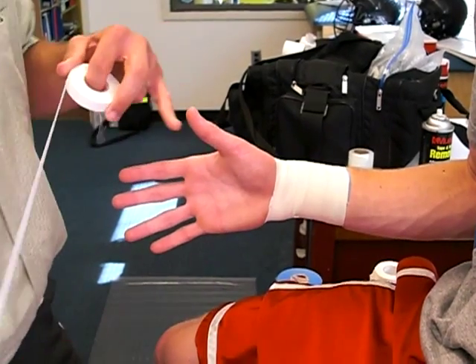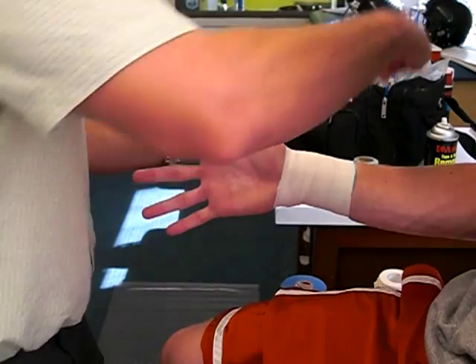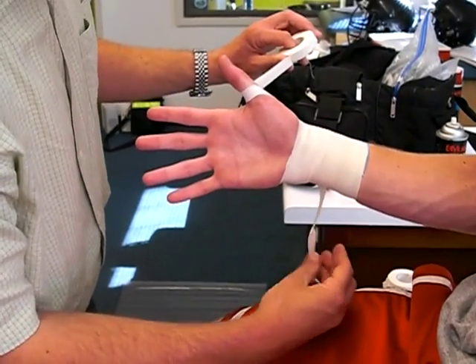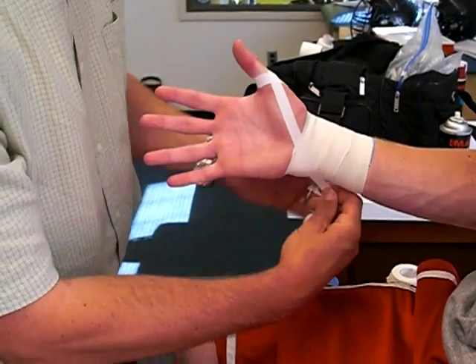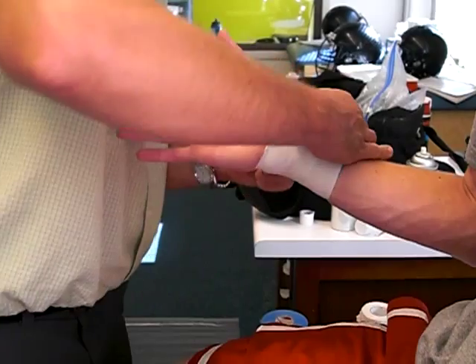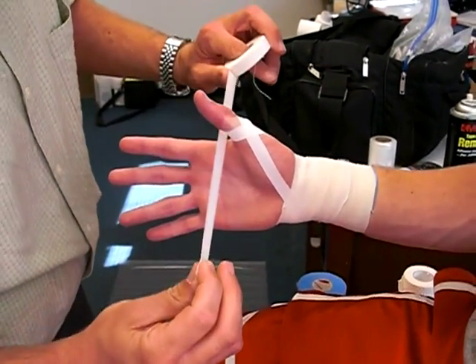Have them already in an abducted position there a little bit, and then you're going to restrict the abduction. So you're pulling down. You wrap it around the backside, and pull down here. We're just using half-inch tape. You can continue doing this all the way up, overlapping by half.